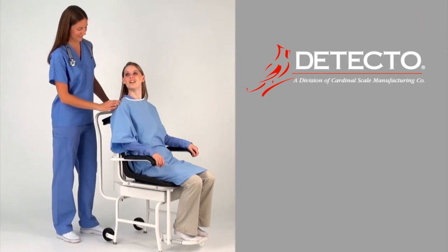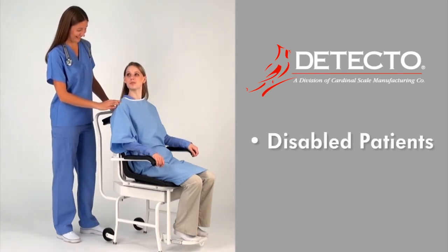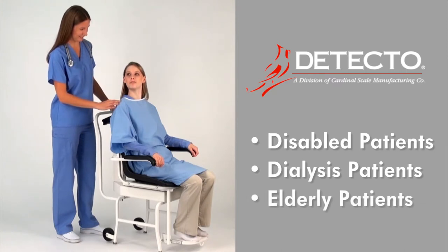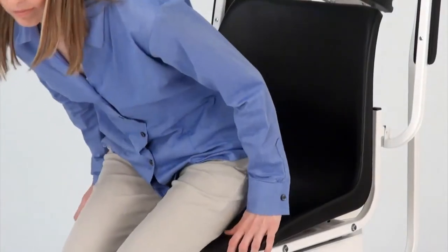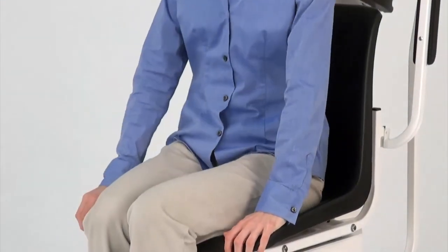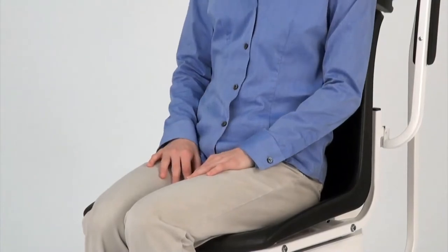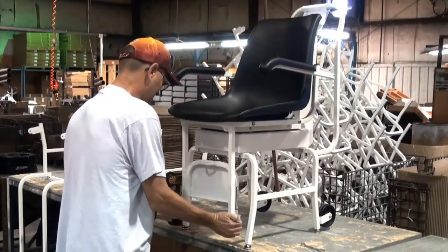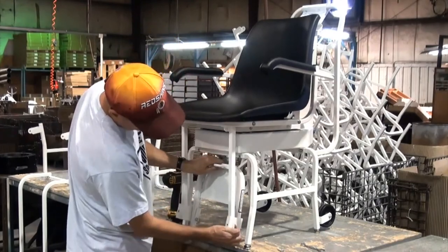The 6475 is of great benefit to disabled patients, dialysis patients, and elderly patients, since it relieves any of the stress involved in the act of standing during the traditional weighing process by providing a place for the patient to sit comfortably while their weight and BMI are measured. Every Detecto chair scale is manufactured in the USA at Detecto's factory in Webb City, Missouri.